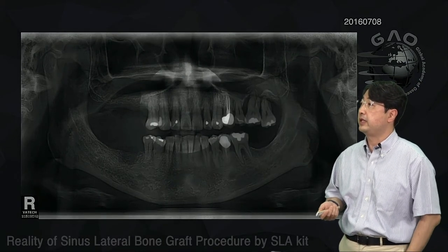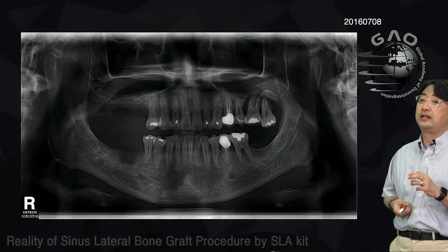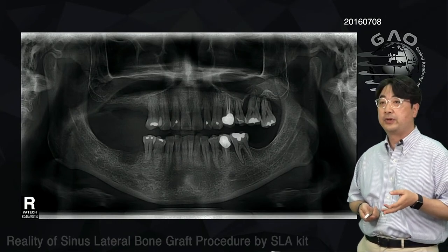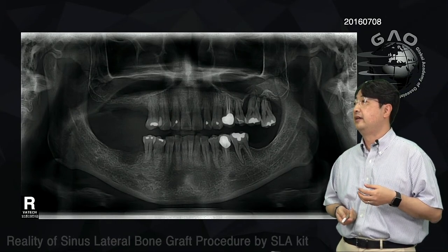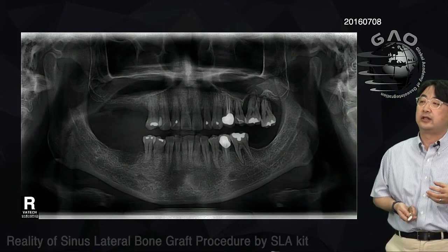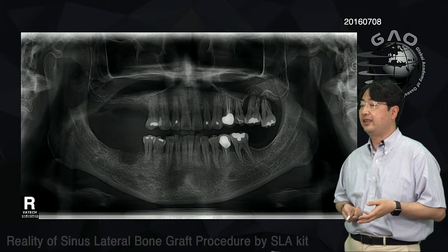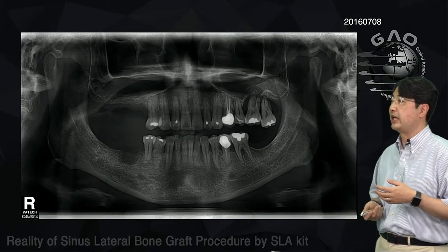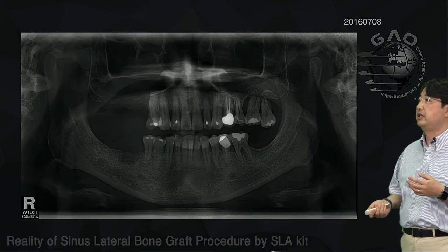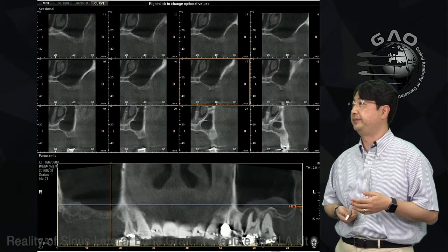Okay, so we have another case, and actually this patient was referred from one of my colleagues. This patient already had a sinus graft on the upper right side. Then my colleague found a perforation during the sinus graft, so he stopped and waited a few months. Then he referred this patient to me for the sinus graft on the right side. As you see here, this patient also needs an implant for the upper left.